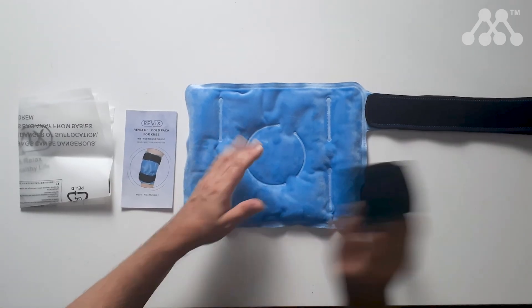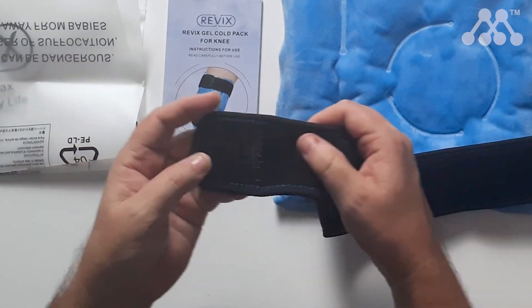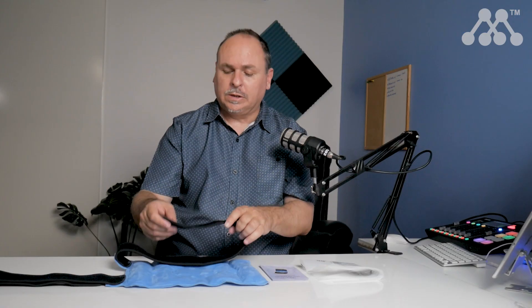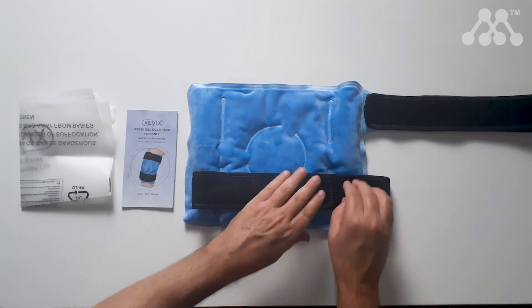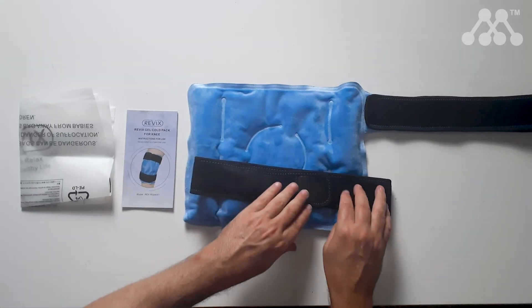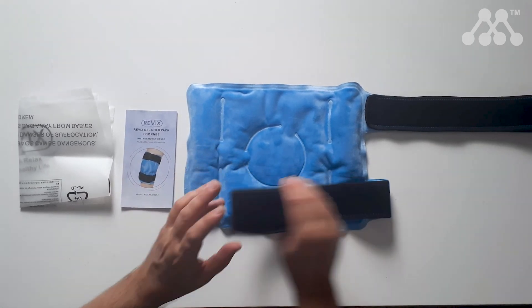To secure it, you have these lovely straps — they're really well made. I'm impressed with the elasticity of them, and the Velcro has really fine hooks and a really nice fur that it connects to. From what I can see here, I'm really pulling this hard and it's not going anywhere, so I think it's going to stay secure to the joint that you apply it to.